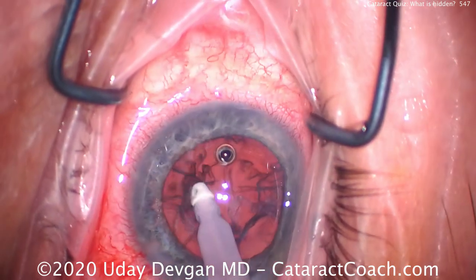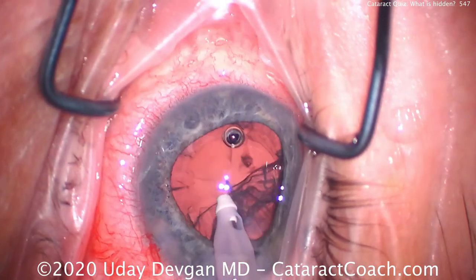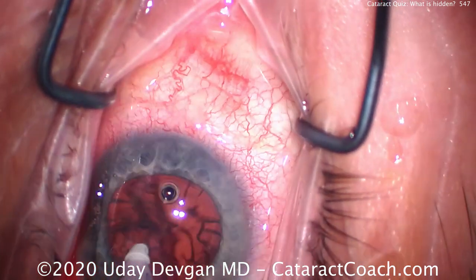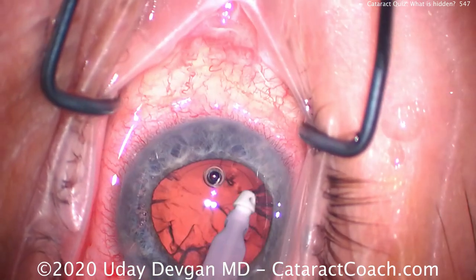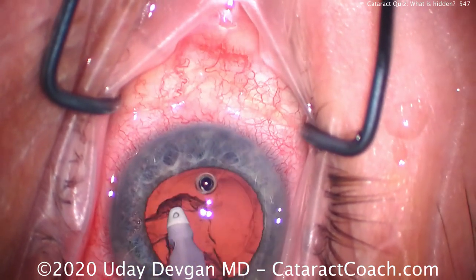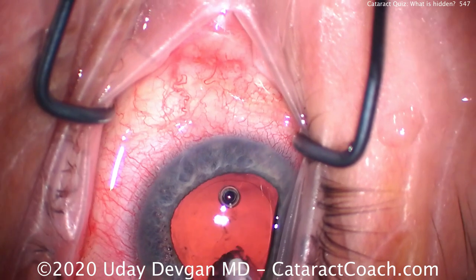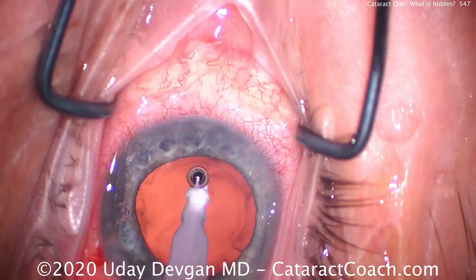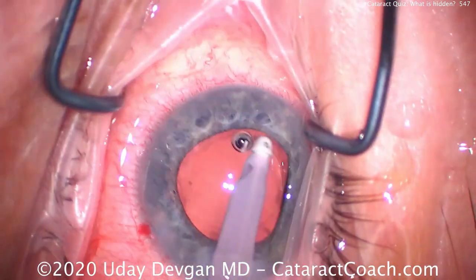Clean up the cortex and then we'll get that piece out. It's important that you as a surgeon are paying attention the whole case, watching carefully. Personally, I'm not listening to music and I'm not talking to anyone else — I am focused on the task at hand. As I keep breaking up the cataract with the chopper into smaller pieces, I'm keeping a mental track of where all the pieces are, making sure nothing is left.